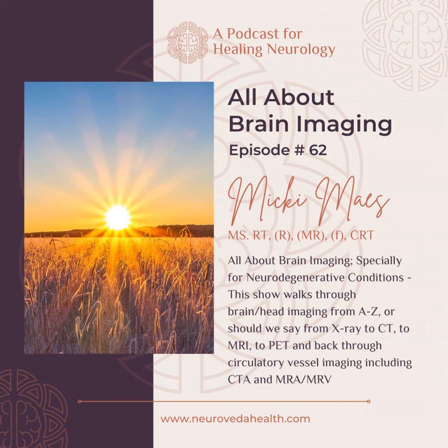And is CT faster than MRI? Yes, by a long shot. Another thing about CT is a lot of times they'll use contrast media for brain imaging, particularly when we're looking at arteries and vessels. And I'll talk about that in a minute too.